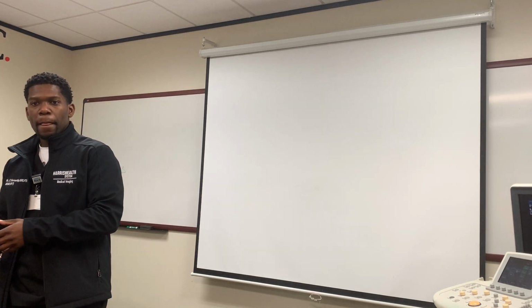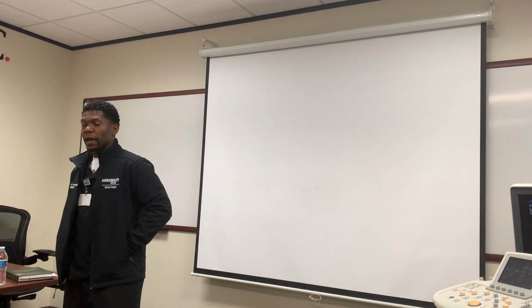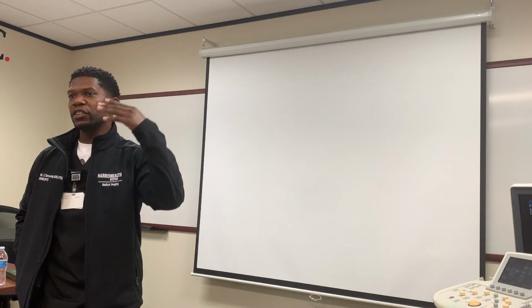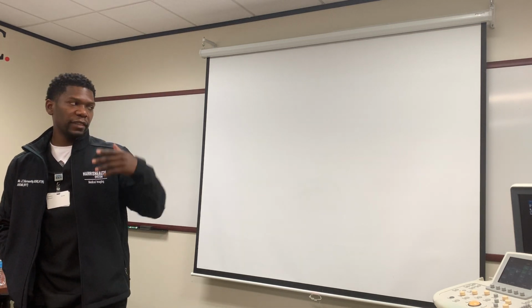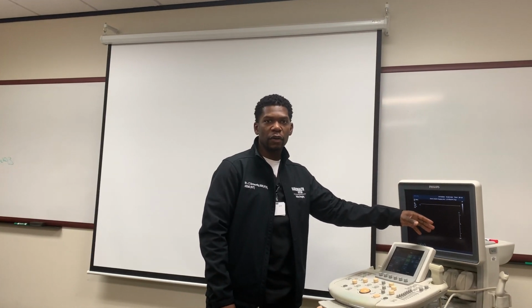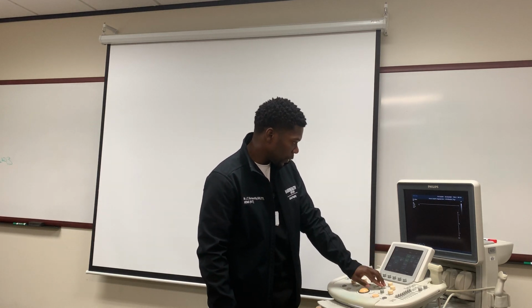So with the least amount of focus, you're going to improve temporal resolution. Absolutely. So right now, with one single focus on this machine, our temporal resolution is already great. It's already high. But if I was to add more, see the thing about this one right here, guys, why I don't have multi-focus on this one is because it has a focal zone. See on here, we can change our focal zone. Where my focus? See, I have it right here.